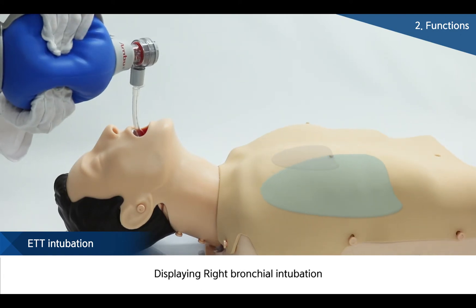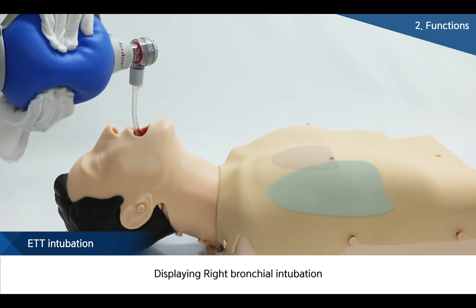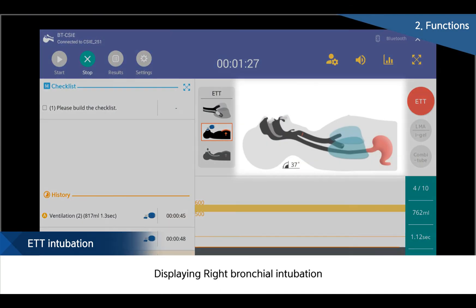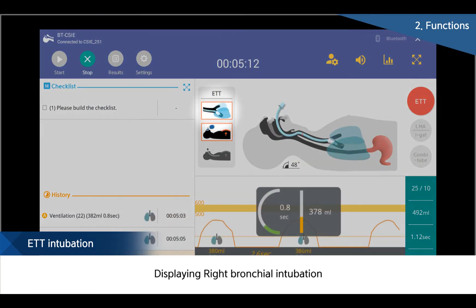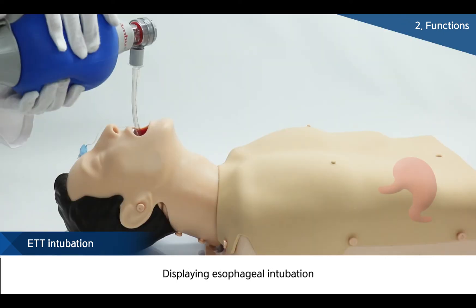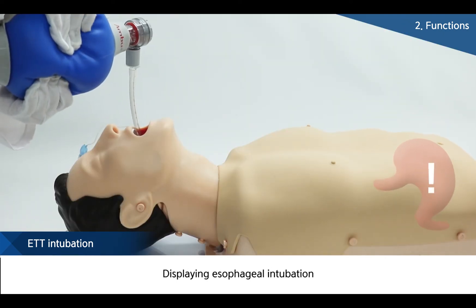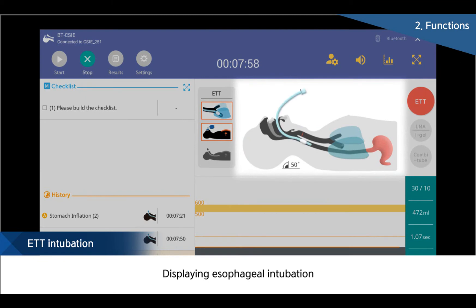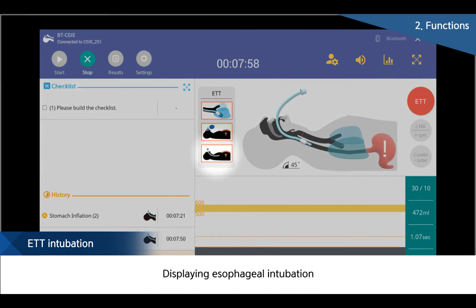When the ET tube is wrongly inserted, such as when inserted too deeply, the product can bring about the rising of one lung depending on reactions following the anatomical structure of the body. Such wrong intubation can be checked on the monitor. If the ET tube is wrongly inserted into the esophagus, it also can be displayed through the tablet PC. Therefore, users can understand the intubation process and procedure completely.